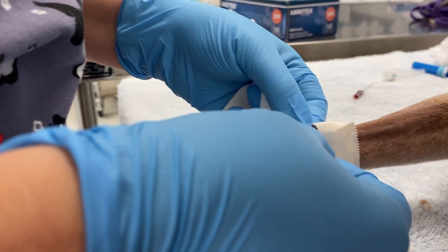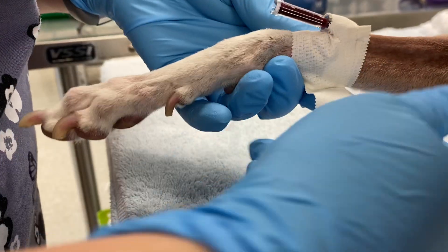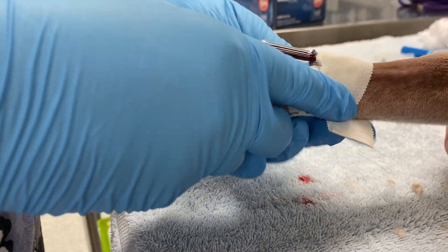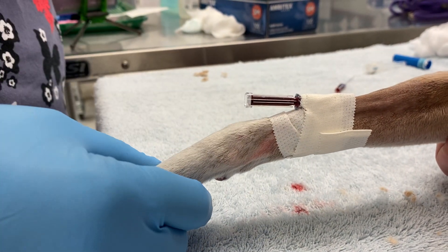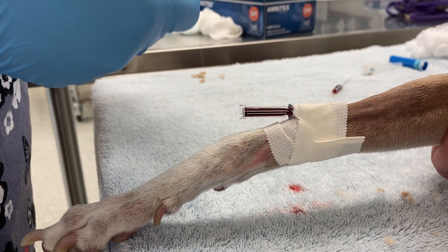Wide piece of tape, sticky side down — slide it up and under, and then flip it back over the top. Just cinch it back down. Notice I didn't pull it really tight; I didn't want it to cause any swelling.